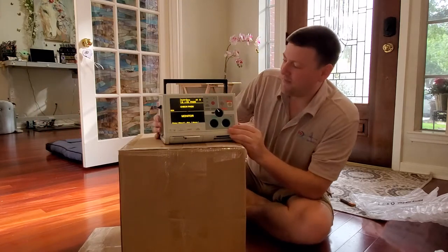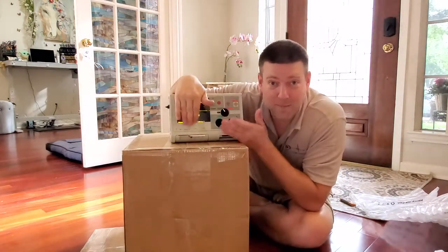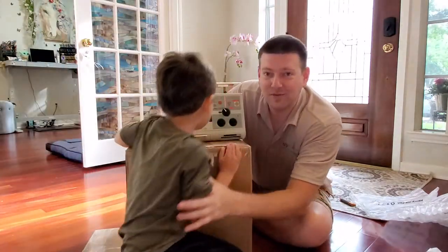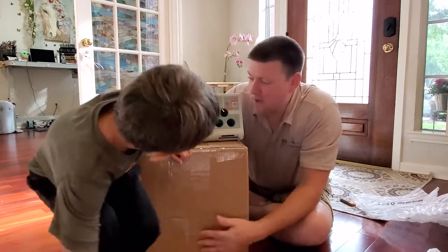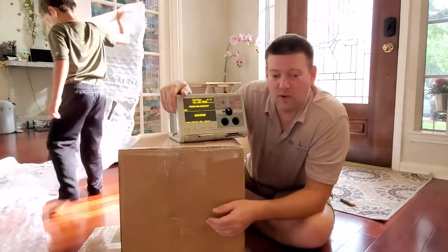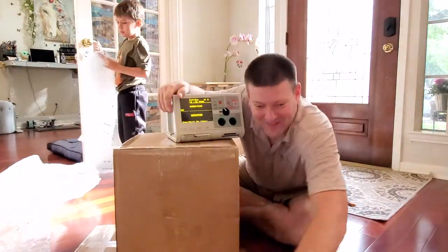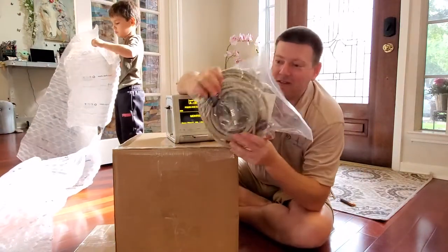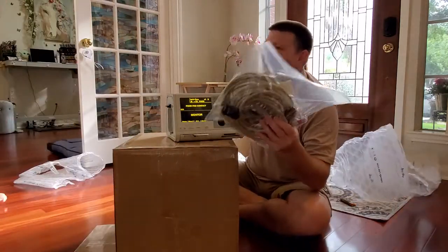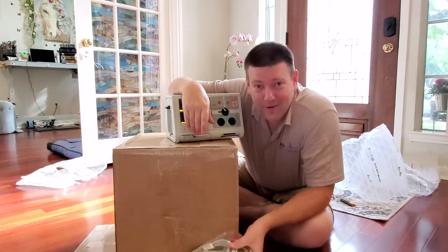It's got ECG out — this is an absolute classic right here, and it looks like it's almost in brand-new condition. This is so crazy, because I wanted to do some videos with a defibrillator — maybe some exploding fruit, and maybe we're going to experiment and see just how safe defibrillators really are. Thank you very much. There are usually a couple hundred dollars' worth of cables in here. The kids are so excited about the packaging material.